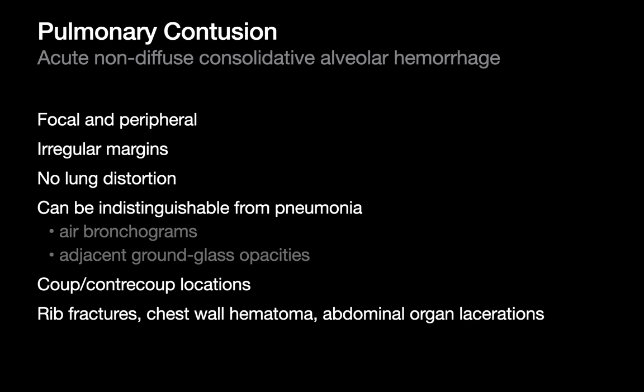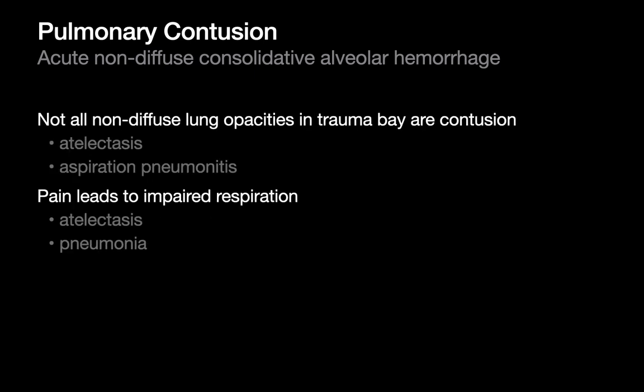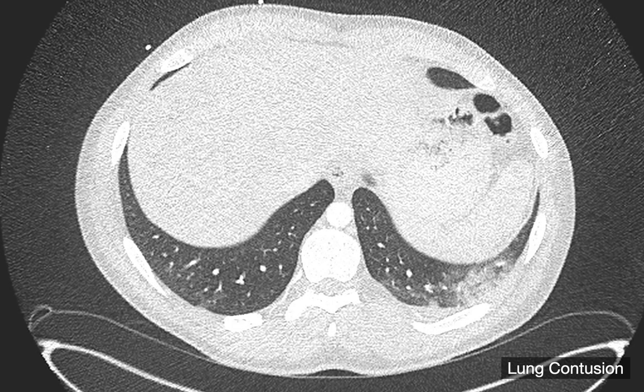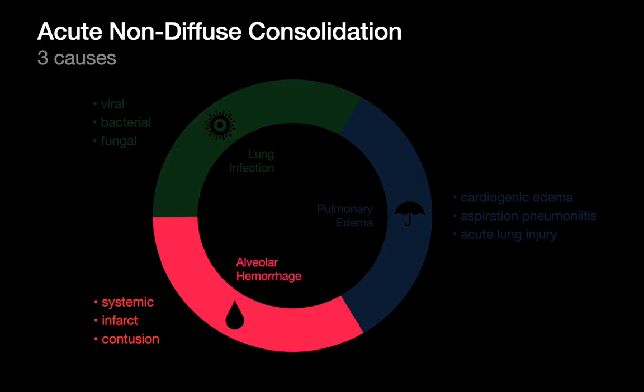Pay attention to signs of superficial trauma near the consolidation — rib fractures or hematoma nearby — and look for coup-contrecoup injury. Not every non-diffuse consolidation in a trauma patient is contusion: atelectasis can mimic focal consolidation, aspiration pneumonitis can occur in the trauma bay, and pneumonia can develop in trauma patients a few days later. Here's an example of contusion in the posterior left lower lobe.